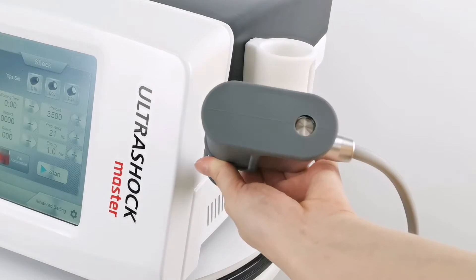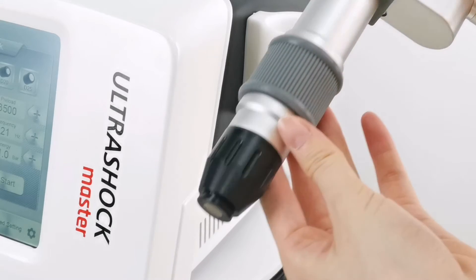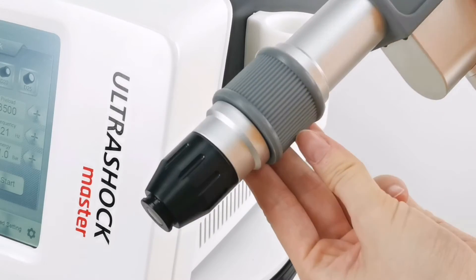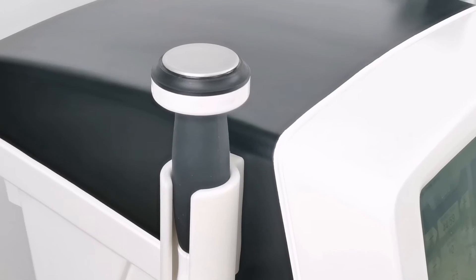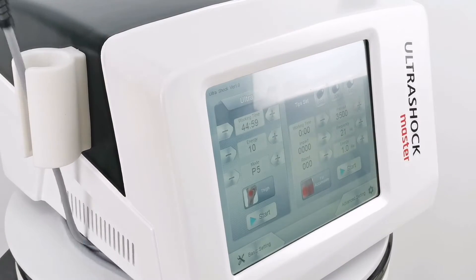The machine supports two standard languages: Spanish and English. It offers 10 body treatment parts for ultrasound, 1 to 10 energy levels, 1 to 5 working modes, and 9 treatment parts for pneumatic shockwave.